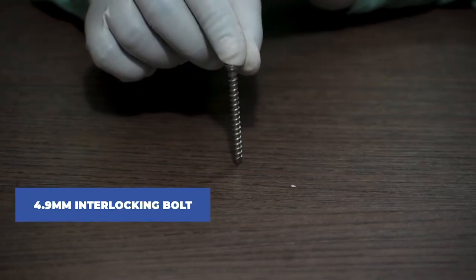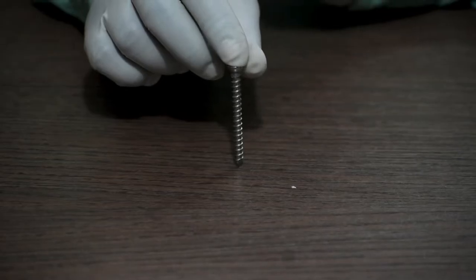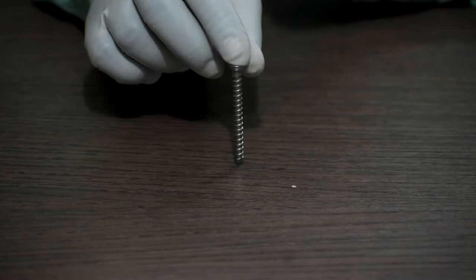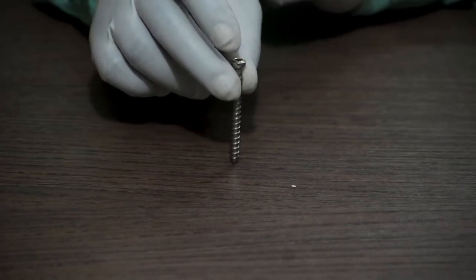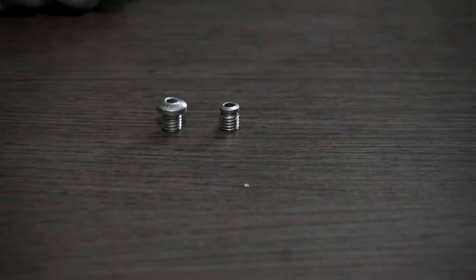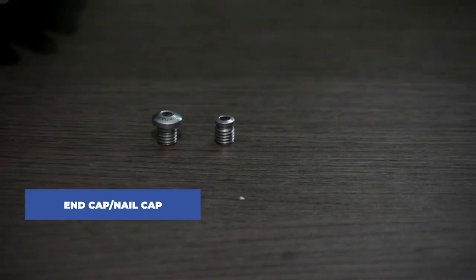Next is 4.9 mm interlocking bolt. Provided in the length ranging from 28 mm to 50 mm. Next is end cap or nail cap.